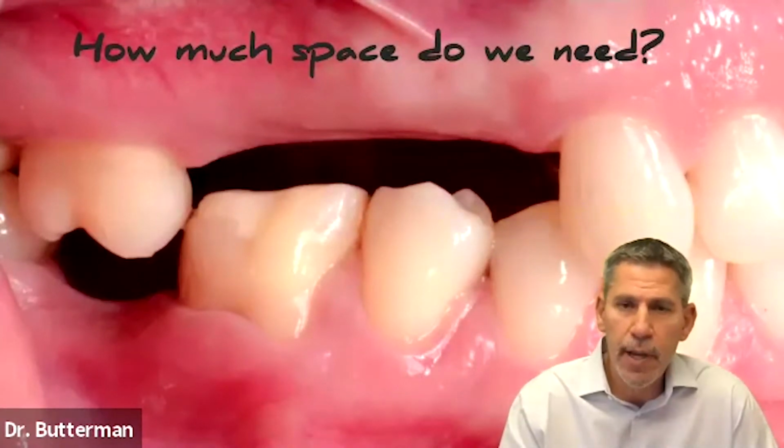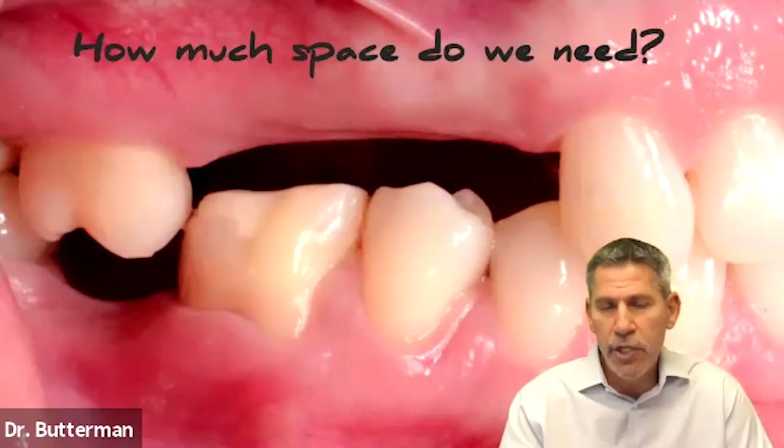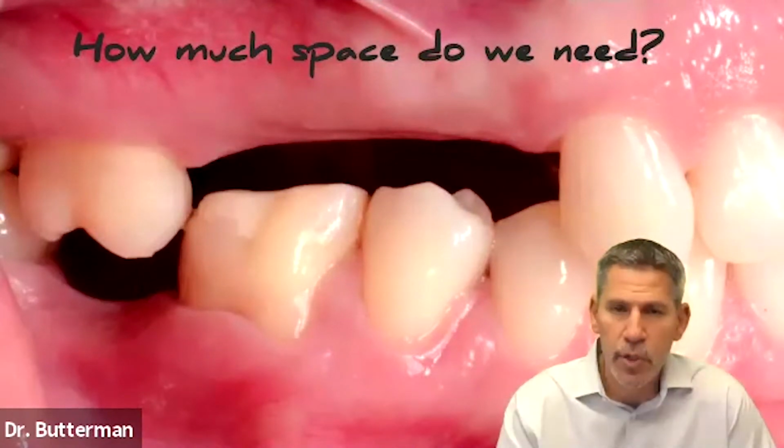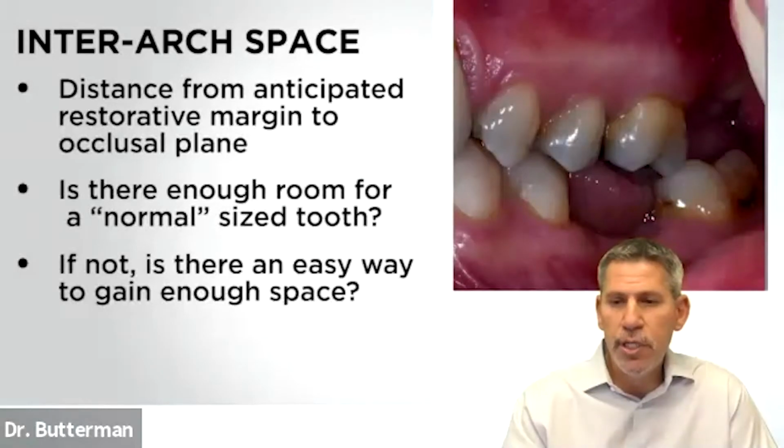I'm going to be using my Axeos scanner for my imaging, so I can see a 3-dimensional X-ray view. And then I'm using my CEREC Primescan for all of my optical imaging. And the two of those merging together is what's basically going to allow me to do all of this. So let's look at a typical case.